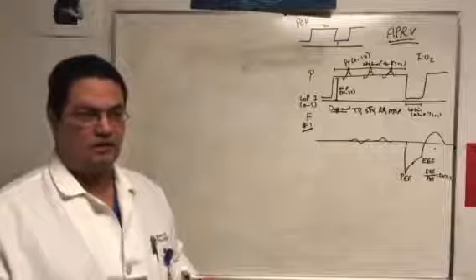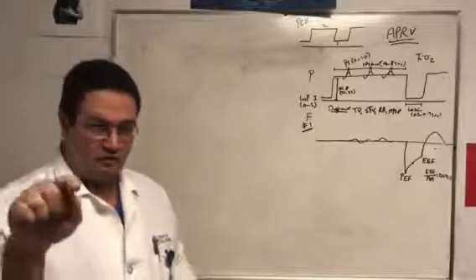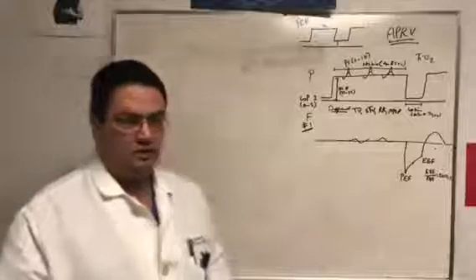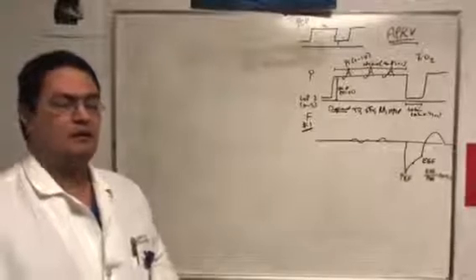It's so easy. It doesn't change the settings. You're not changing the settings, so nobody's gonna slap you on the hand and say, well, don't change the vent. Freeze, move the cursor, get these two numbers and measure them. And alert the respiratory therapist, say, listen, you haven't seen this for some time and this is whatever.